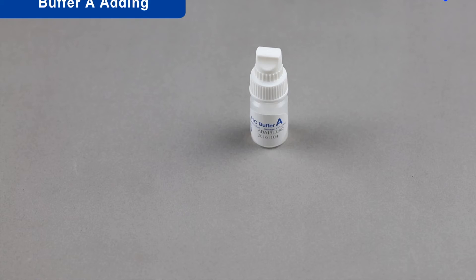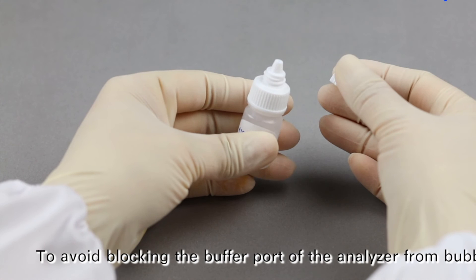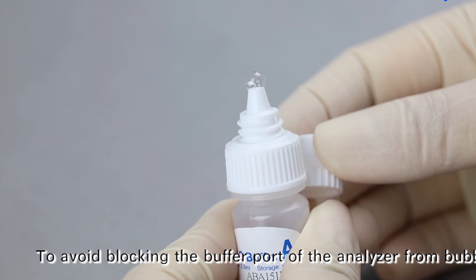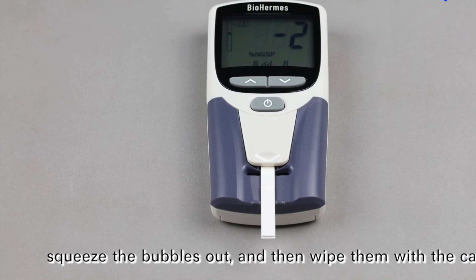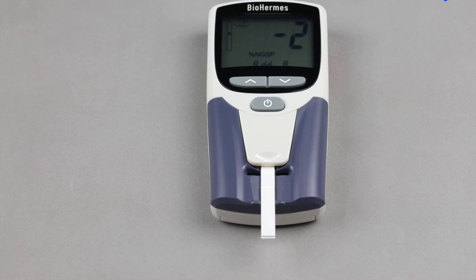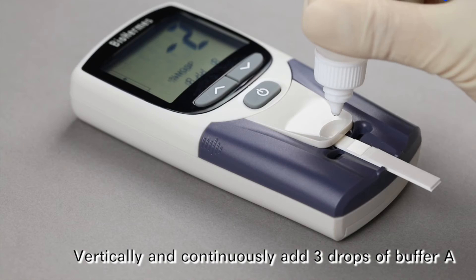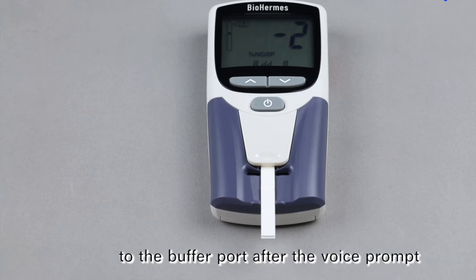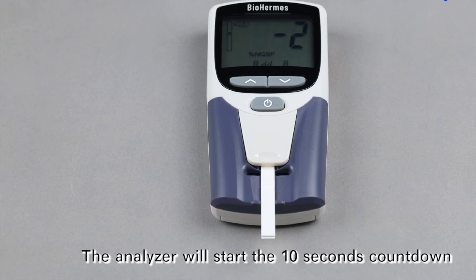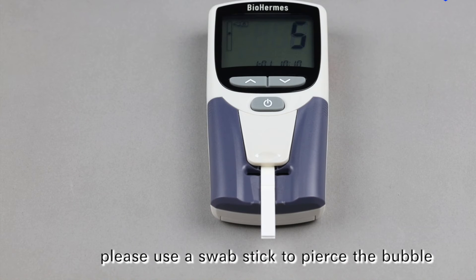Buffer A Adding. Unscrew the upper cap of the buffer vial to open it. To avoid blocking the buffer port with bubbles, squeeze the bubbles out and wipe them with the cap. Vertically and continuously add 3 drops of buffer A to the buffer port after the voice prompt. The analyzer will start a 10-second countdown. Note: if a bubble blocks the buffer port, use a swab stick to pierce the bubble.